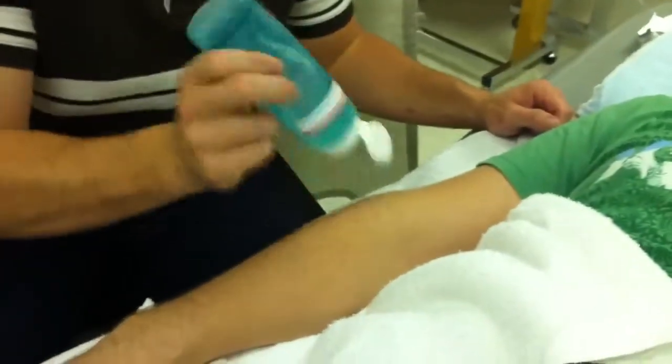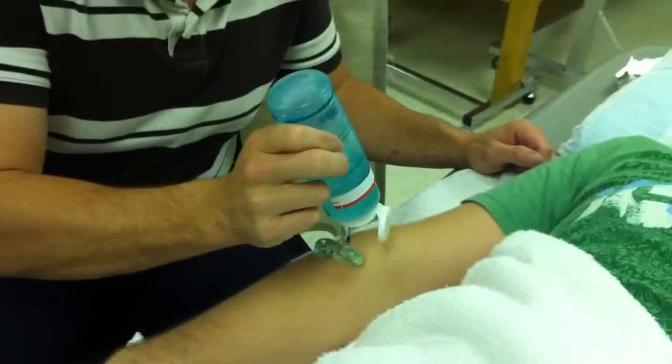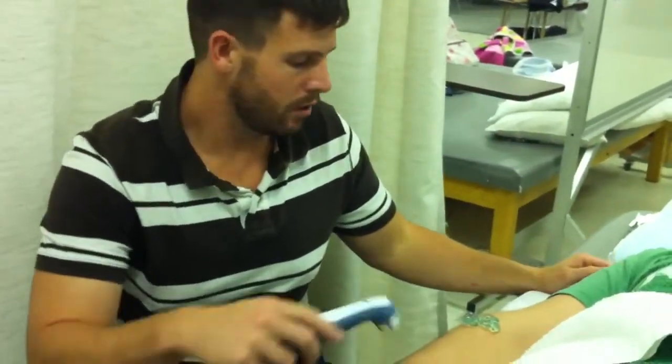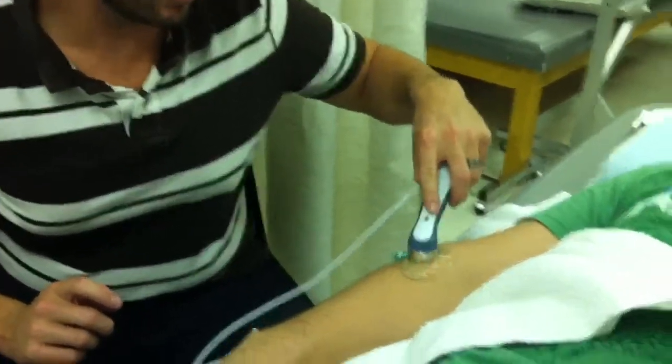You want to have a generous amount of gel, because you want to make sure that you always have gel in between the sound head and the skin. It's going to act as a medium and a lubricant as well. Once you get the head on there, kind of rub it around in the area that you're going to be treating.